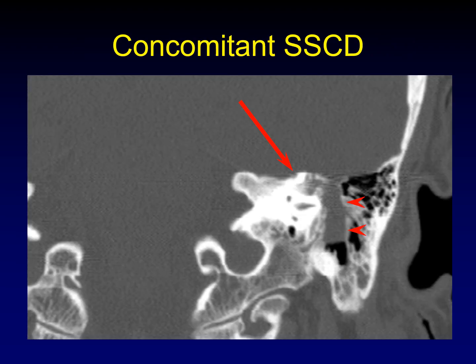Remember to look for concomitant superior semicircular canal dehiscence. Here there is thinning of the entire tegman, a large encephalocele has come down through the tegman mastoidium into the mastoid air cells, and the superior semicircular canal is also dehisced — this portion of the tegman and that portion are both thinned.